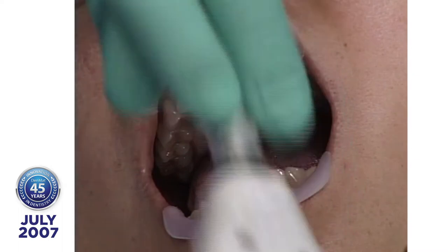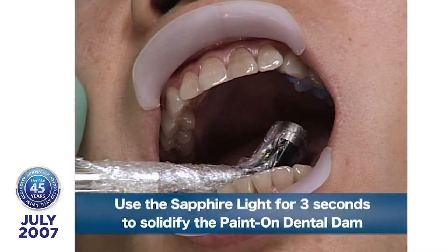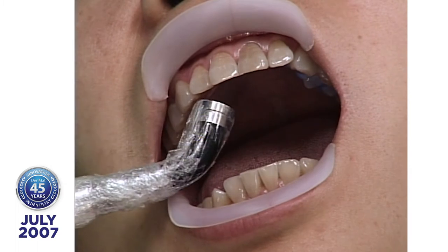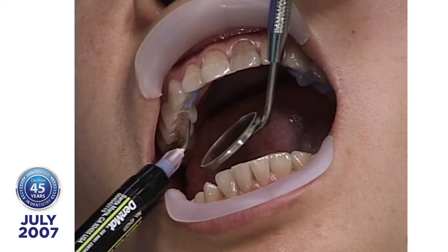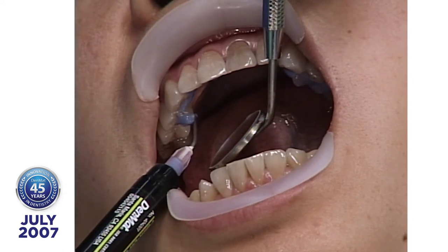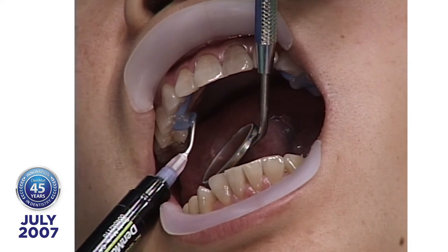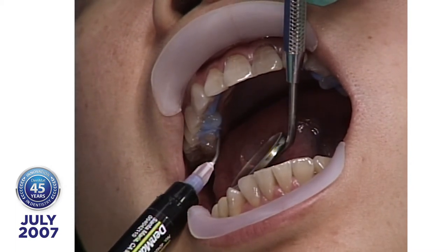I'm placing the paint on Dental Dam on the lingual side and exposing it to the light for three seconds. The best way to protect your eyes is to close them — I place the light, get a finger rest, hold it, then look away and close my eyes. When patients have spaces between their teeth, be careful not to obliterate the space from the lingual to the labial, because then you won't get the ultra-bond on the tooth. Fortunately, she doesn't have any diastemas today.